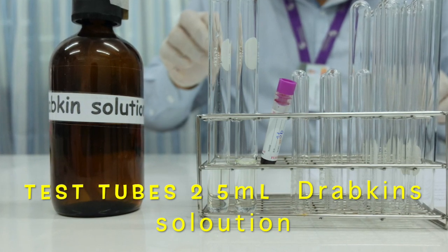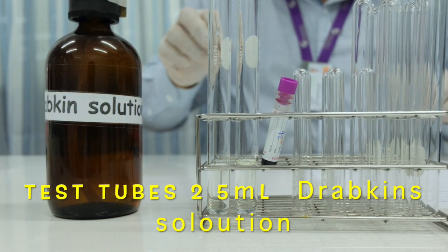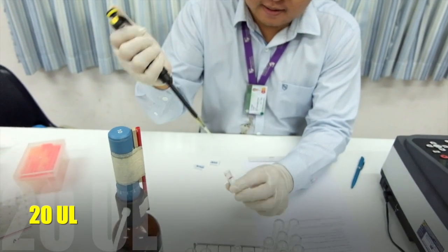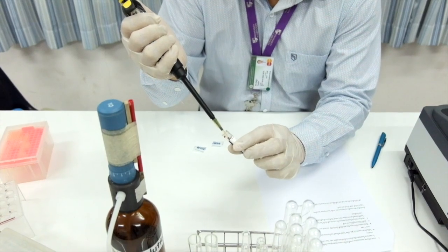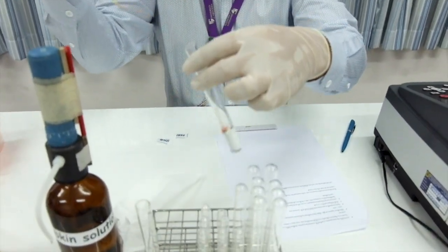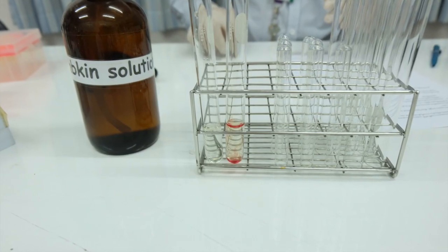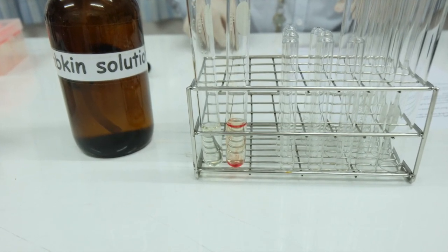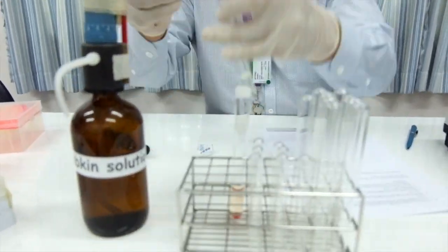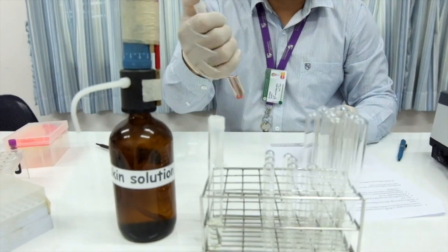Prepare 2 test tubes containing 5 ml of Drabkin solution. Pipette 20 microliters of the unknown blood sample into a tube with 5 ml of Drabkin solution. Beware of excessive blood sticking outside the tip. Cap the tubes with paraffin and mix by inversion.